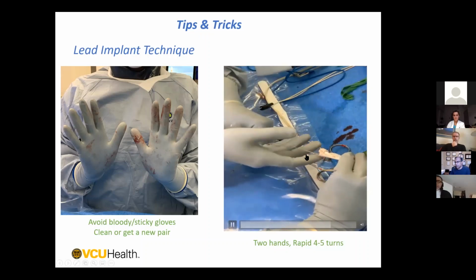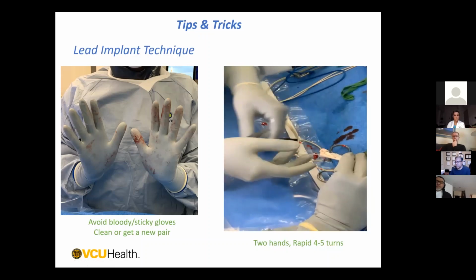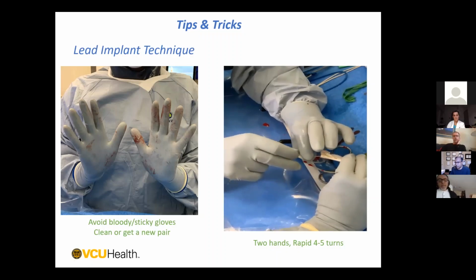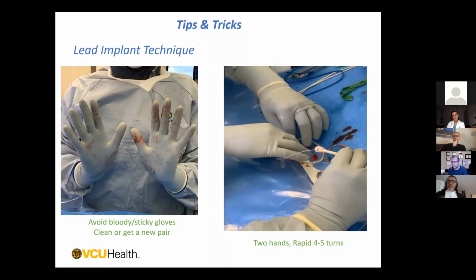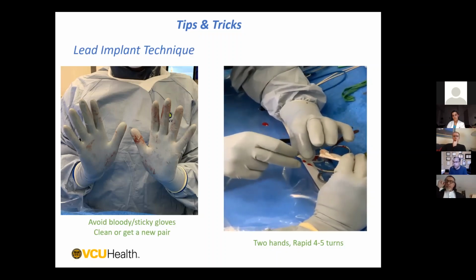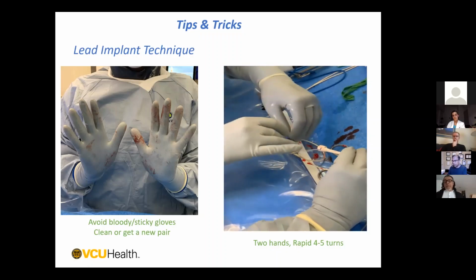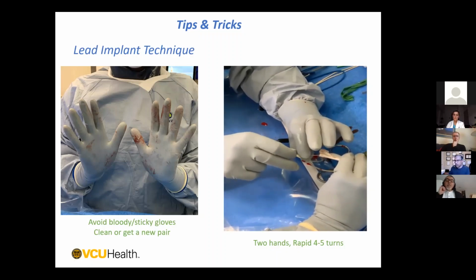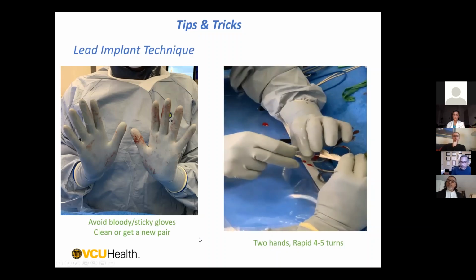And here he's rotating it a lot faster than I do it, and I'd be interested to hear from other people. But I've found that over time I've slowed down my rotations, because I find that if there is some scar or fibrosis in the septum, you're more likely to dig through it by doing a very careful, gentle, but forward pressing rotation rather than trying to turn it really, really fast. I don't know if other people have a comment about that.